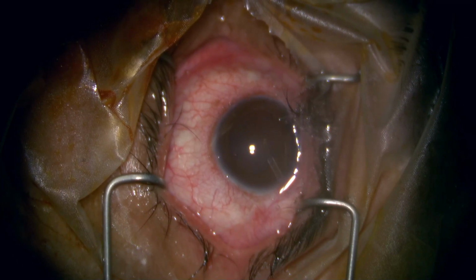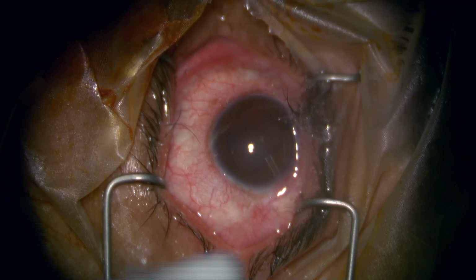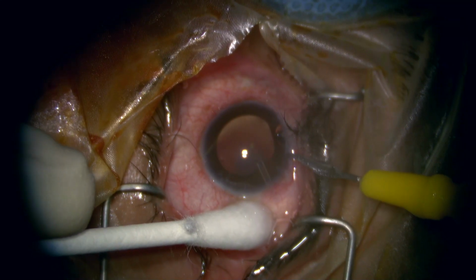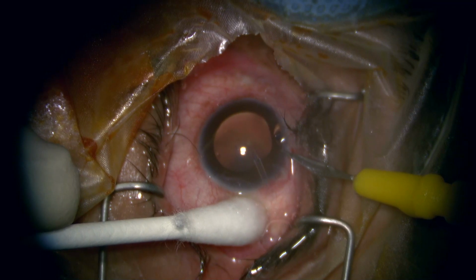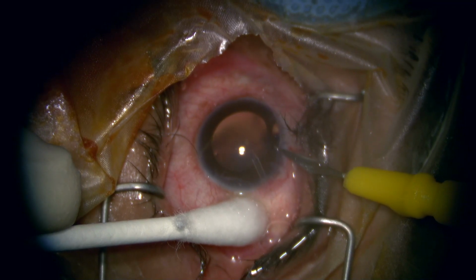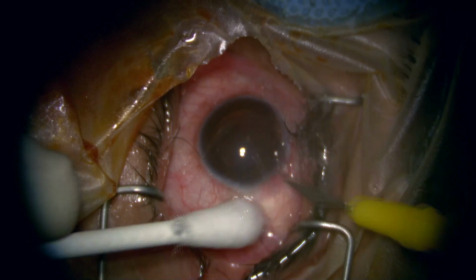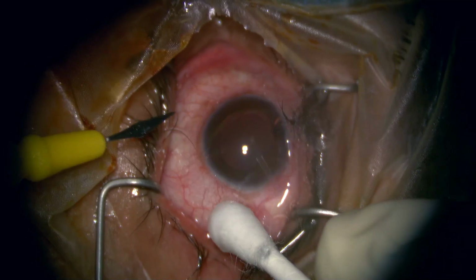The aim of this demonstration of this difficult case is to show a cataract surgery with phacoemulsification after TRAB and AGV in a case of uveitic glaucoma.